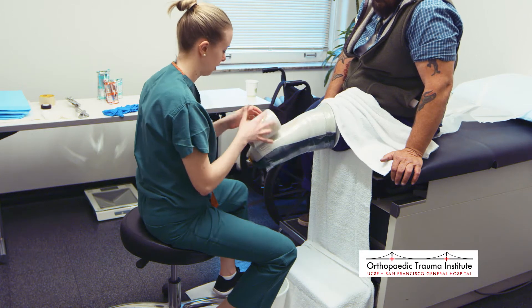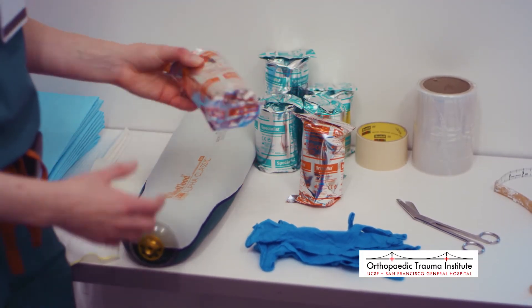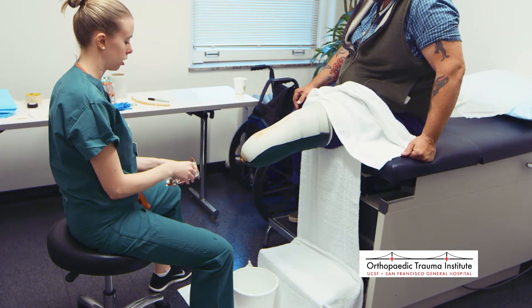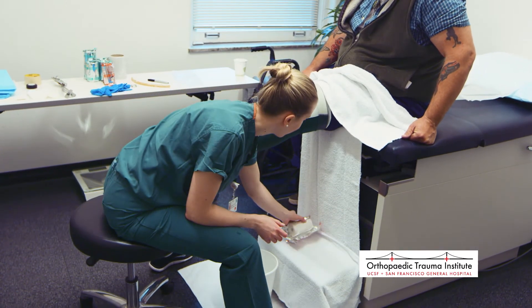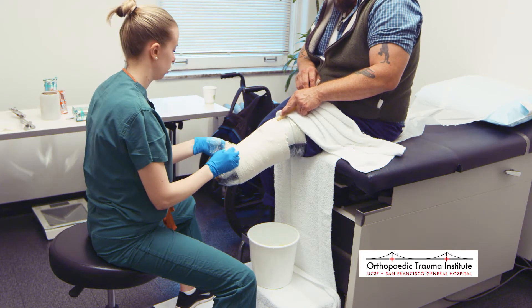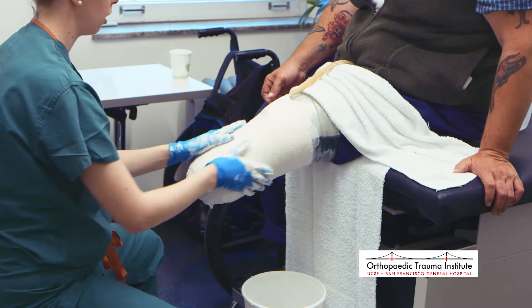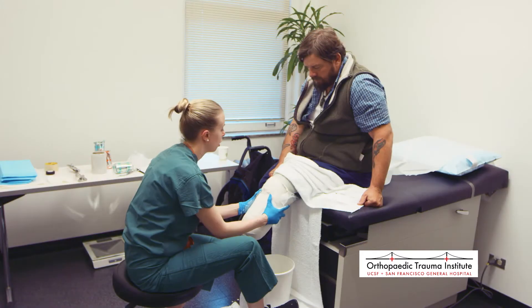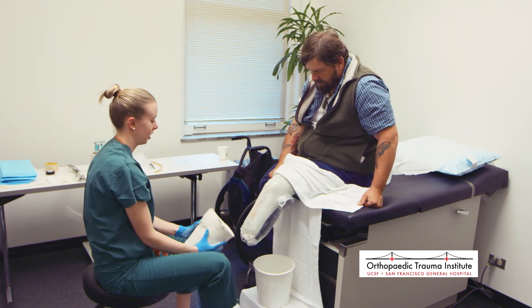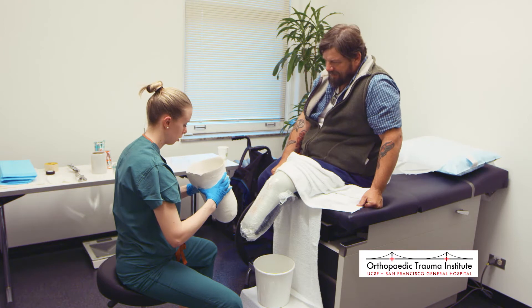The Saran Wrap protects the gel liner and helps tighten everything around the leg. Then we have our plaster — we use plaster for casting instead of fiberglass because we think plaster gets a really nice intimate mold. We use a variety of different plaster wraps and water to capture the shape, making it really thick. It can get a little warm during casting, but with the gel liner acting as a barrier, it should never be uncomfortable. This plaster cast is removed right away — it's also washable, so if it gets on your clothes, it can be washed right off.